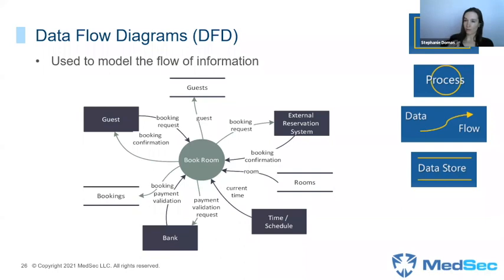Recall, asset-based is all about figuring out the assets of the system, and so you have to do that in some kind of methodical way. So data flow diagrams, you'll often hear them just called DFDs, is a way of getting all of those assets on paper. So the idea is you're building a representation of where data goes, where it's stored, and how it's used. There's a few just sort of known symbols, and you're using arrow flows. The whole idea is that you're representing where data goes and where it's used, because at the end of the day, that's always the thing typically under attack. It's where data is being used, it's where data is being stored, it's where data is being transmitted.